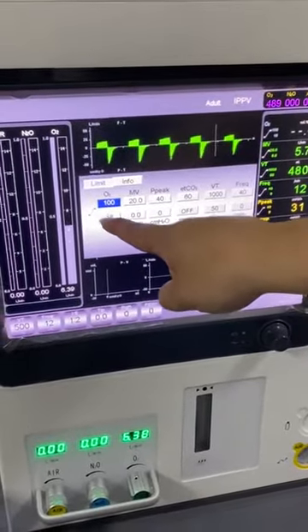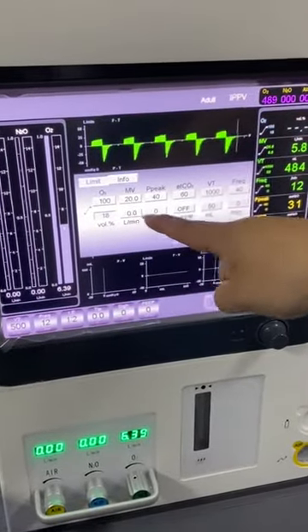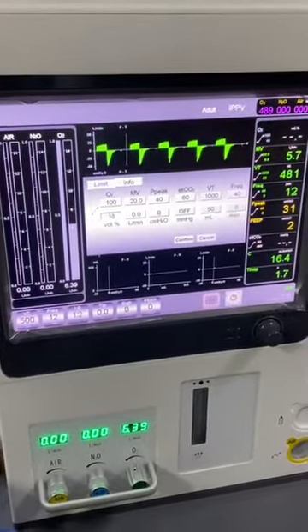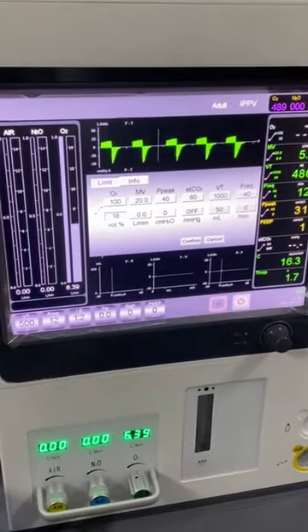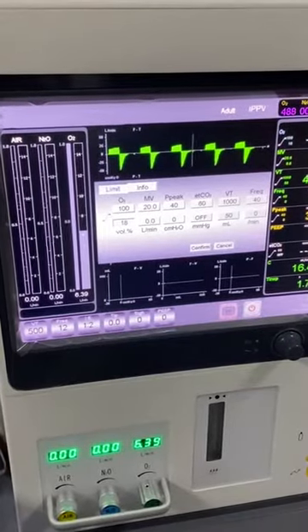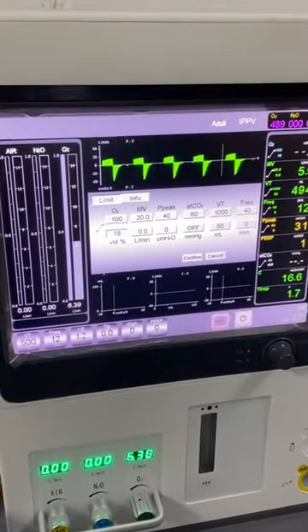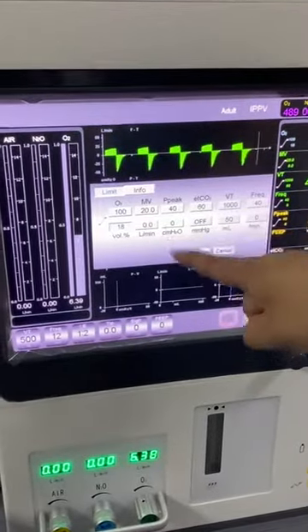For example now, if we set the oxygen concentration lower limit at 18%, then the machine will give an alarm only if the oxygen is less than 18. Usually, before shipment in our factory, we already set it very well, no need to change. But in some countries, the standards or the patient figure may be much different. For some, like we Chinese, or some people in Africa or in European countries, the body shape is different. So doctors can change it as per their preference.